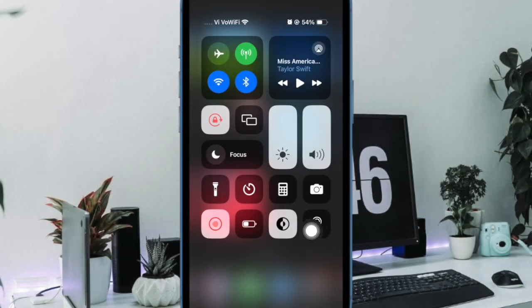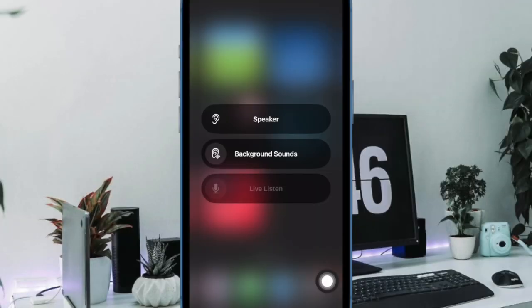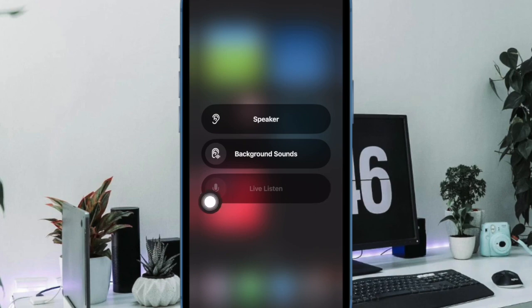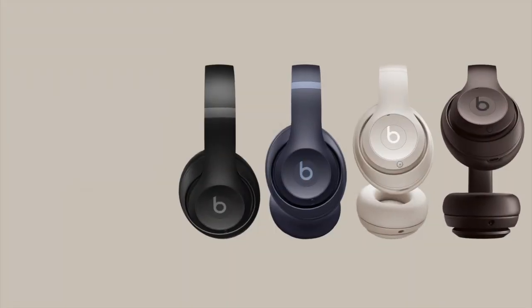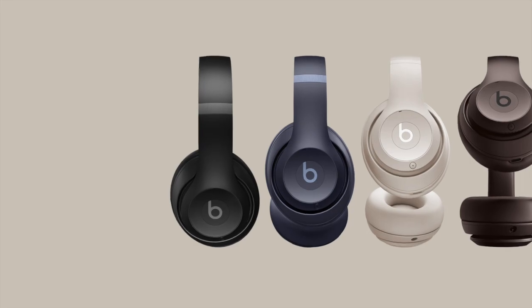Then tap on the hearing icon. Then tap on Live Listen. Then place your iPhone or iPad close to the person you want to hear, preferably in front of them.